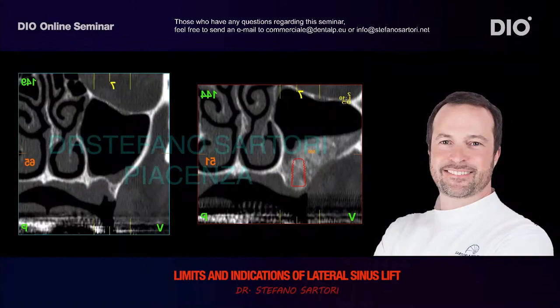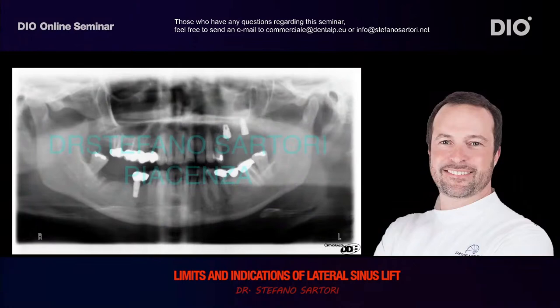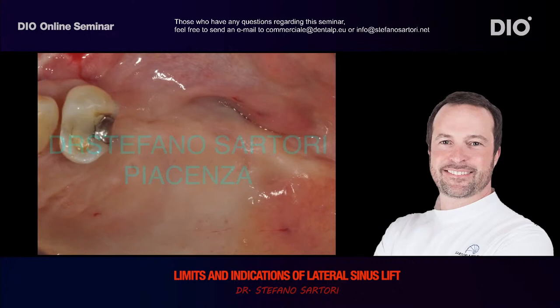On the left, the defect before; on the right, after regeneration in the implant simulation. These are the implants positioned in an X-ray aspect. And here you can see, after the healing period, the insertion of the muscles at the crest level. That's why, even more than in the last case, it is still more important that I move a piece of keratinized palatal tissue from palatal to buccal.